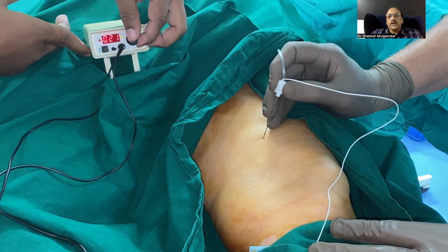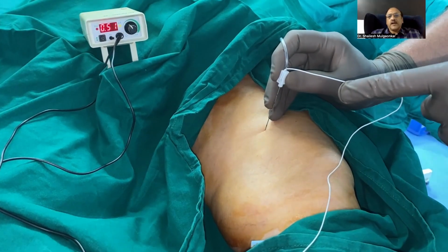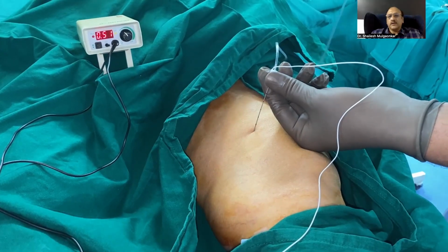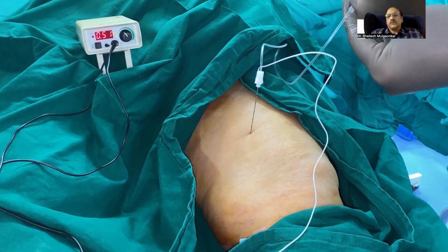Then again increase to 0.5. Again at 0.5, it comes back. That means you are definitely not intraneural and definitely not far away from the nerve. And then you inject 1 cc and the end motor response will stop. So that is called a Raj sign.